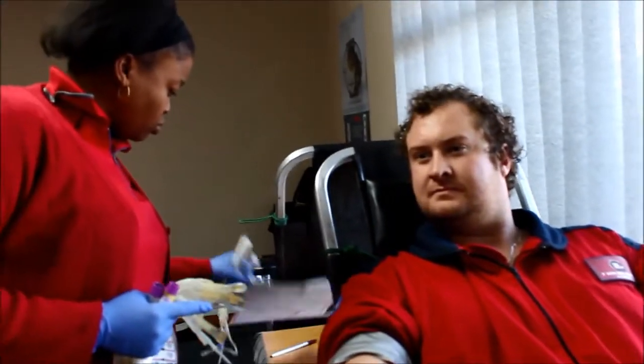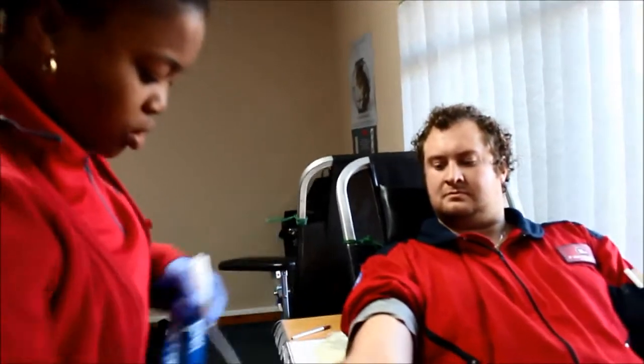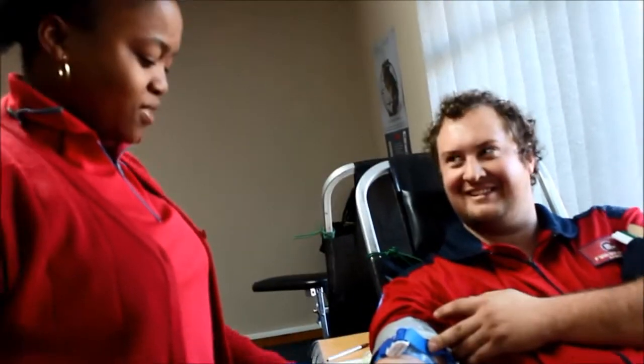Dates of birth? 1989.09.28. What are you checking now? Checking his veins. That is a very good one. Oh yeah, I found one.